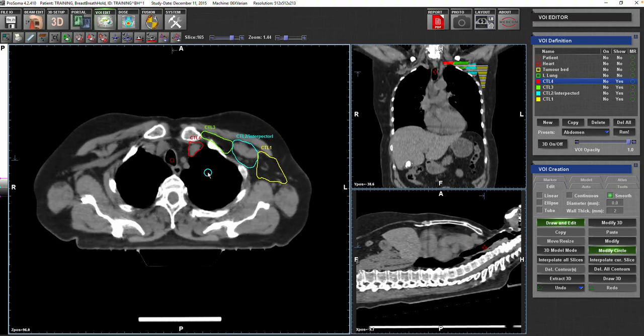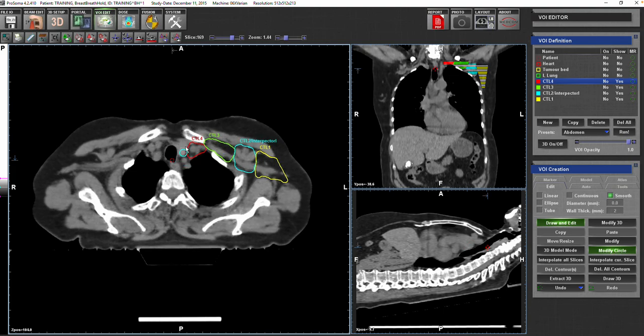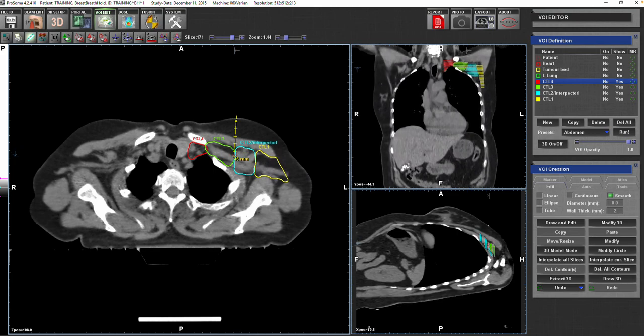I usually draw this drawing for me in the field-based things. So I want to do something quick to know exactly where I'm putting my field. This is number one. And number two, for plan acceptance, when you say, for example, I want to give a direct field prescription, you have a feeling about how deep is your volume. This will give you an idea about how deep is your volume.